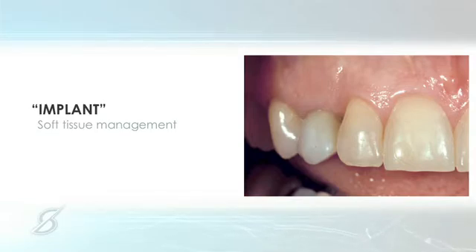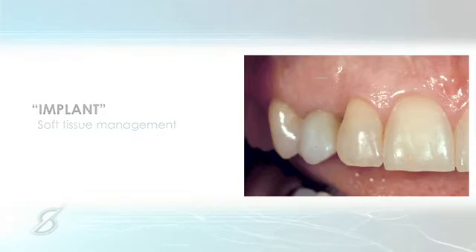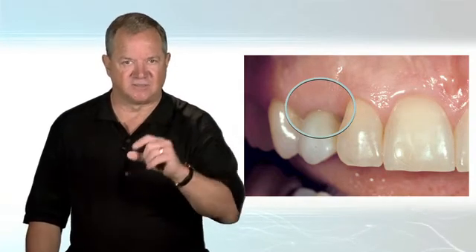The lab didn't want to push on the tissue, and so the lab made this little tiny canine crown with this long abutment extending up through the tissue to the head of the fixture. Now, this is an interesting case in that this dentist redid this crown 3 times because the patient didn't like it, but all 3 times the technician made the crown the same length.